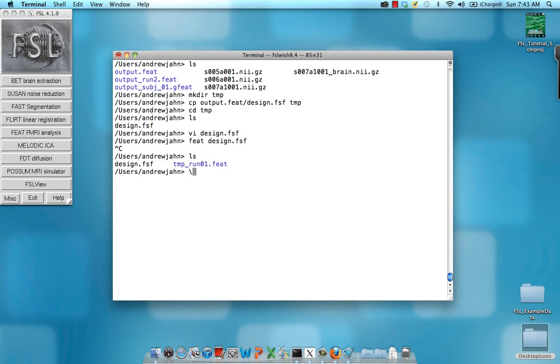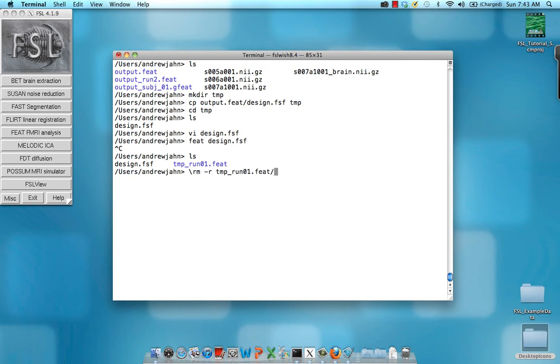And that it's output everything into this new folder, temp underscore run 01.feat. Move that for now. So that's all good.